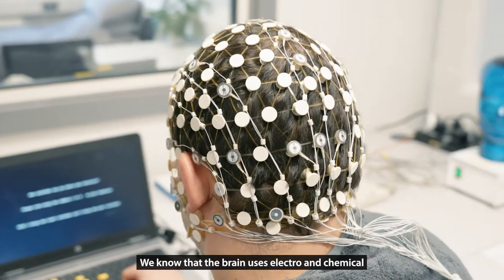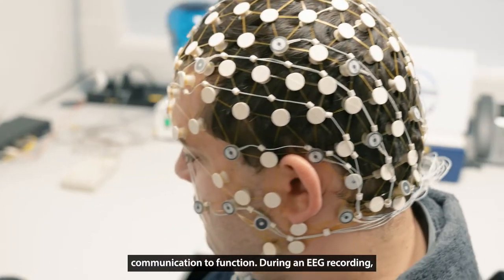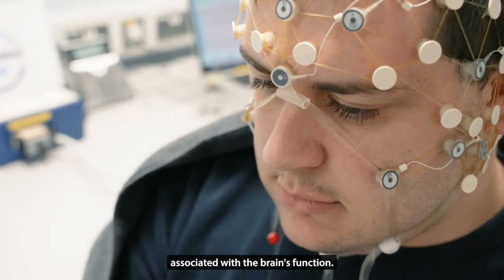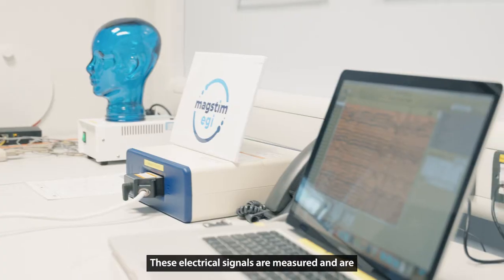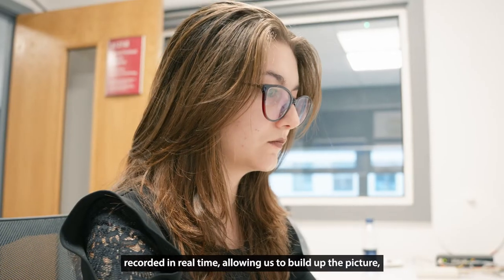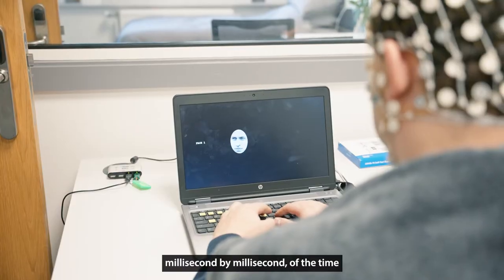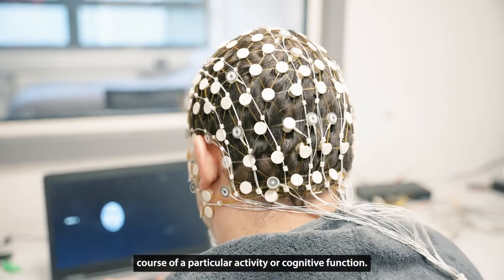We know that the brain uses electro and chemical communication to function. During an EEG recording, we're simply measuring the electrical activity associated with the brain's function. These electrical signals are measured and recorded in real-time, allowing us to build up a picture, millisecond by millisecond, of the time course of a particular activity or cognitive function.